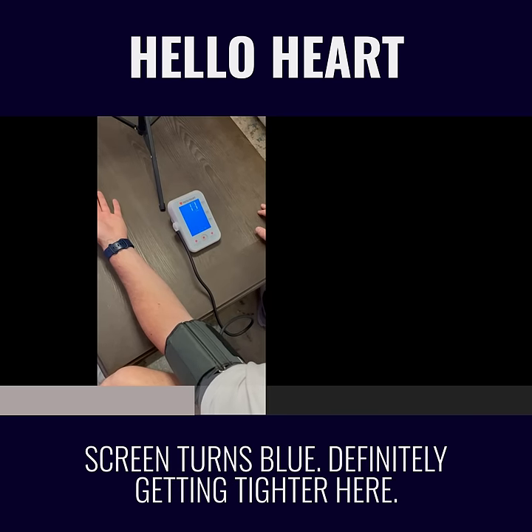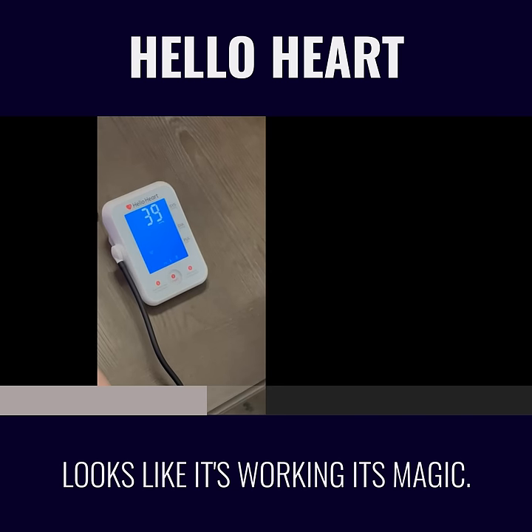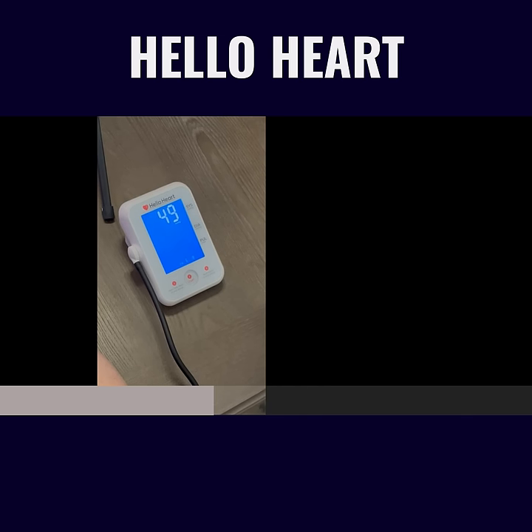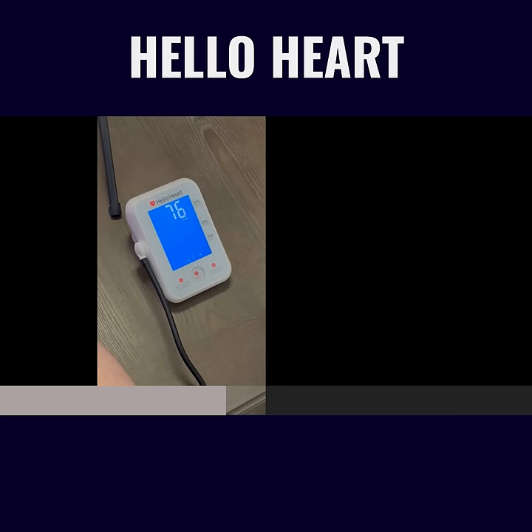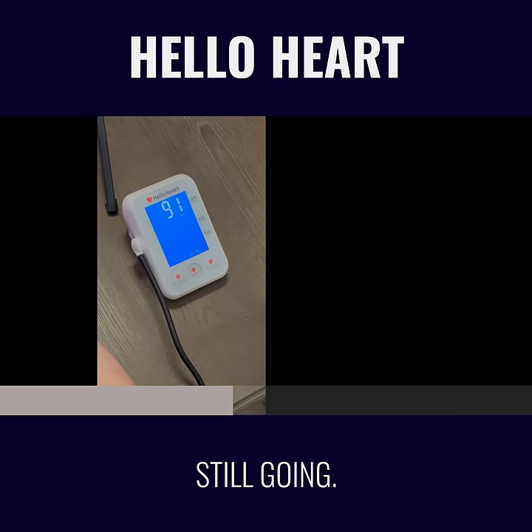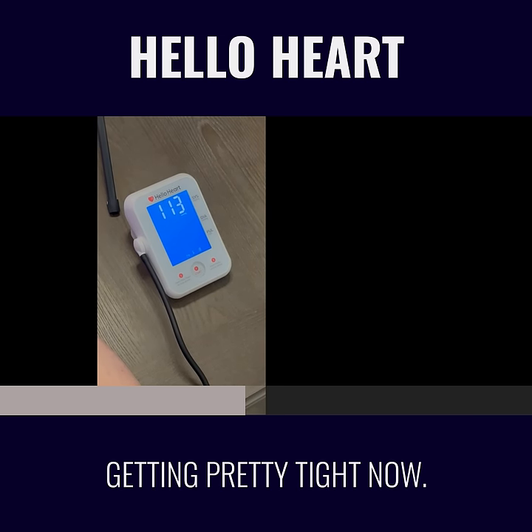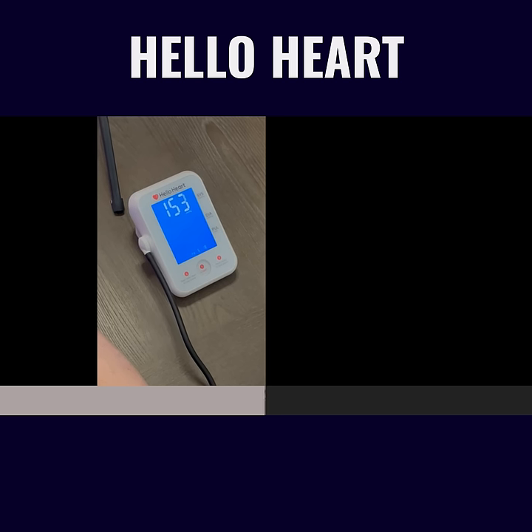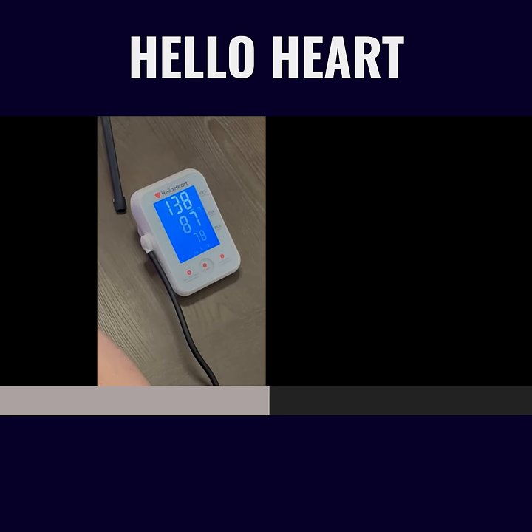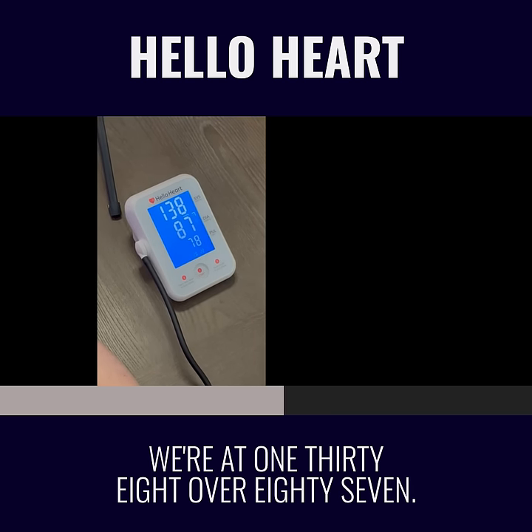The screen turns blue. Definitely getting tighter here. Looks like it's working its magic. Still going. Getting pretty tight now. It looks like making this video got me a little anxious — we're at 138 over 87.